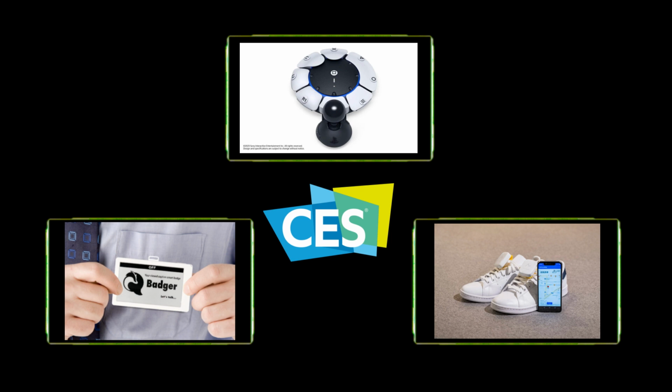A pulsing forward vibration is an indication to move forward. Right and left vibrations indicate turns, and both feet vibrating notifies the user to fully stop.